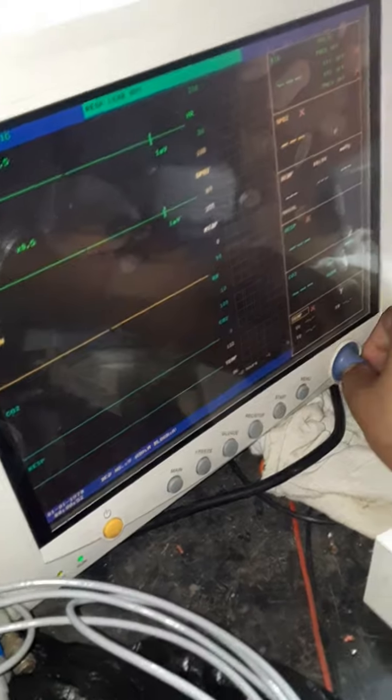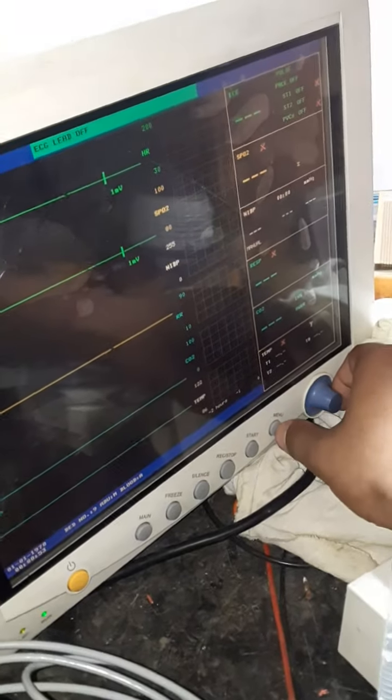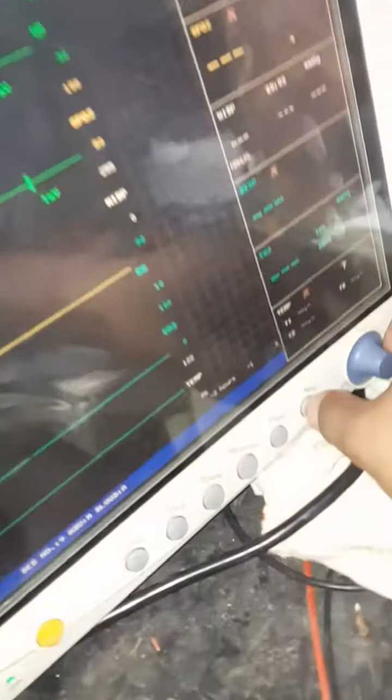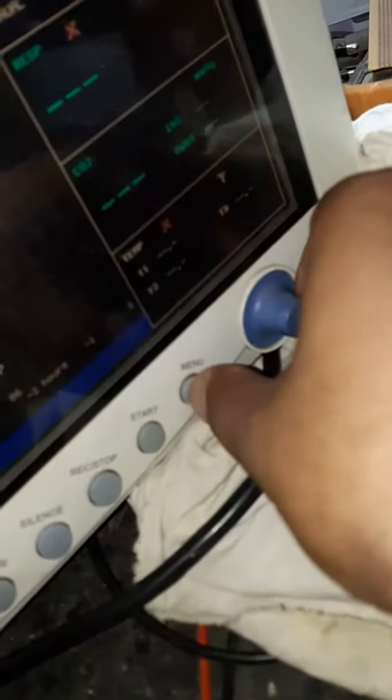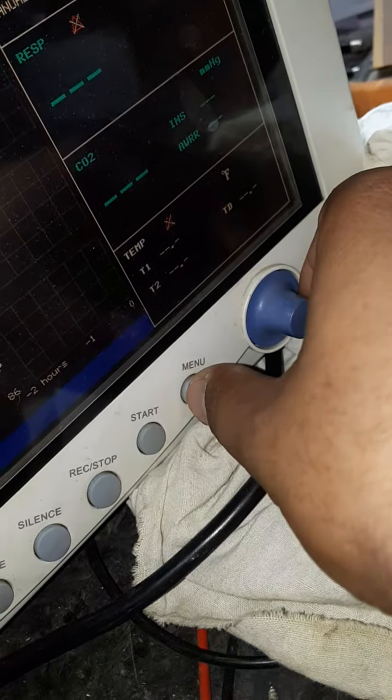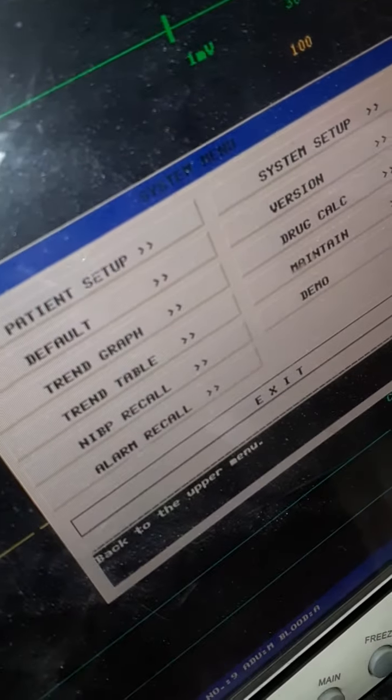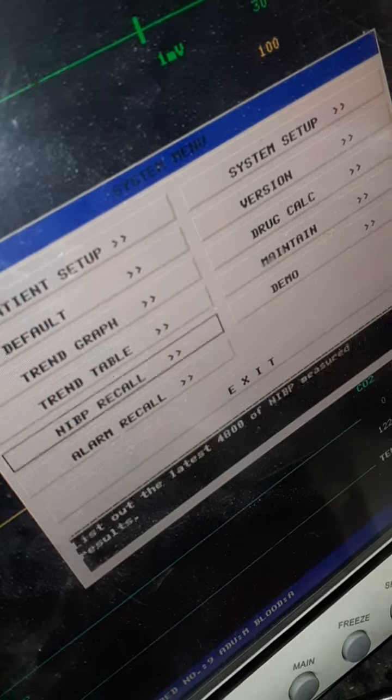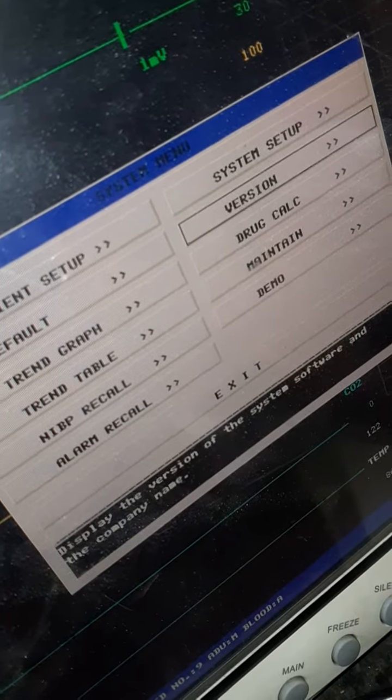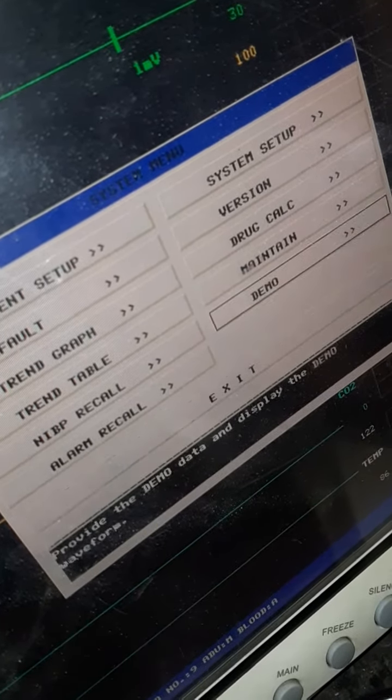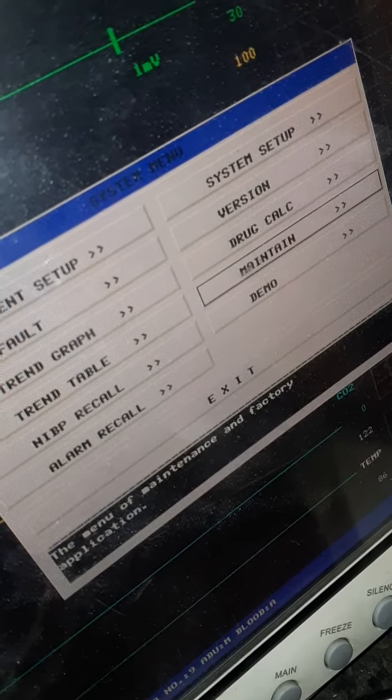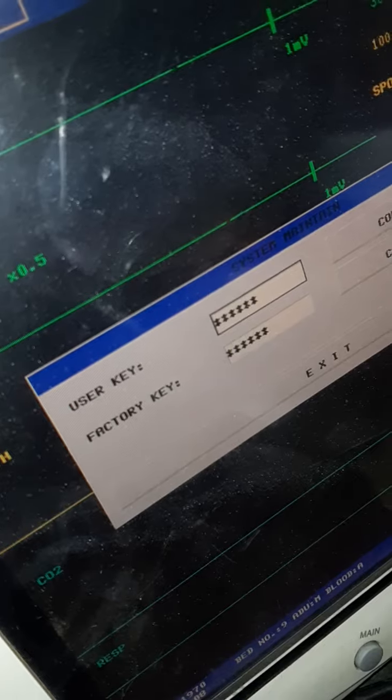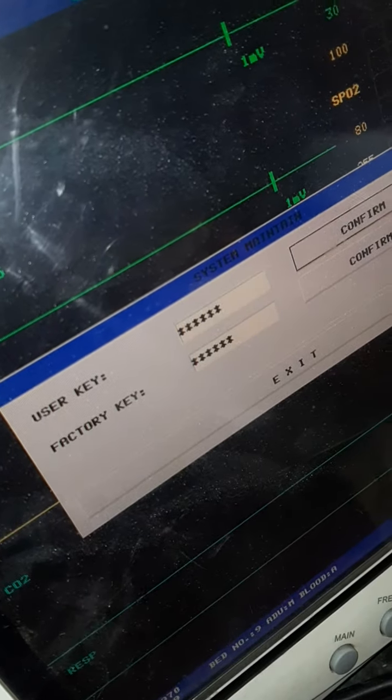First, you have to press the menu button. After pressing the menu button, you can see the settings. Go to the maintain option - the second to last option. After clicking maintain, there are two settings: user key and factory key.